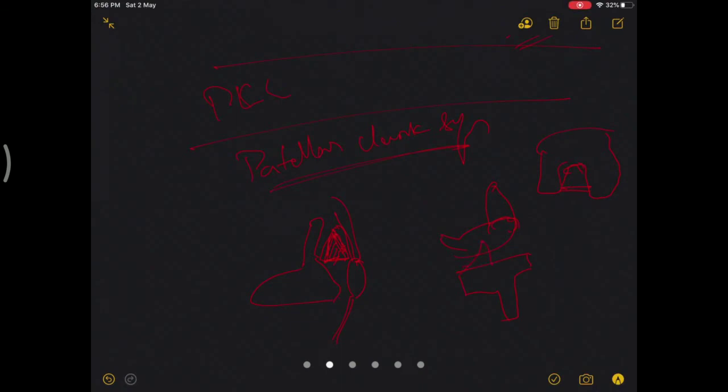So what happens if you don't take out this pad of fat? Then every time there is a flexion extension, this fat pad is stuck in this sharp notch, and it starts forming a nodule there. So the flexion extension will not be a smooth process.